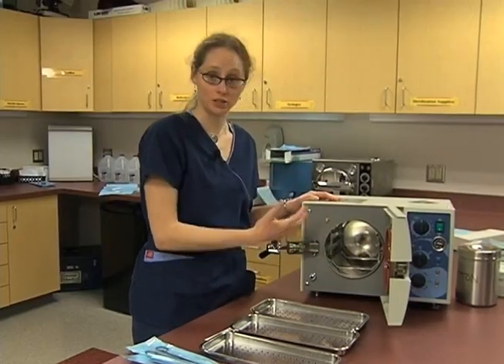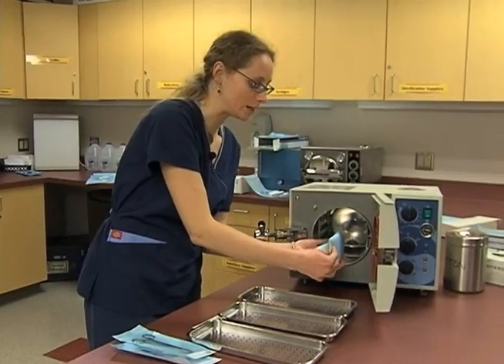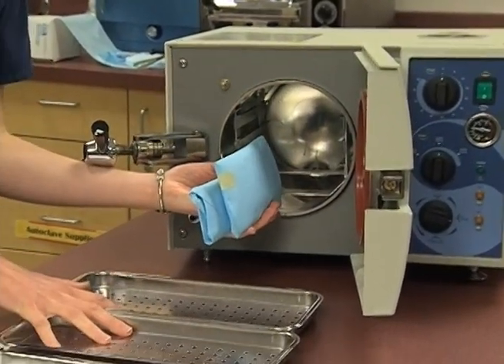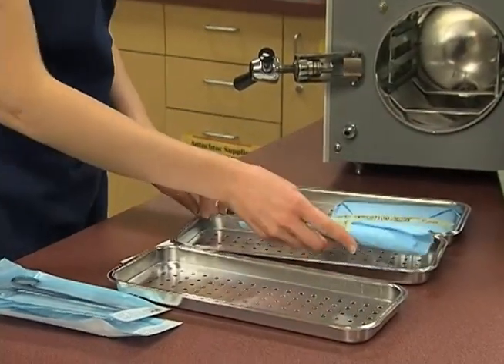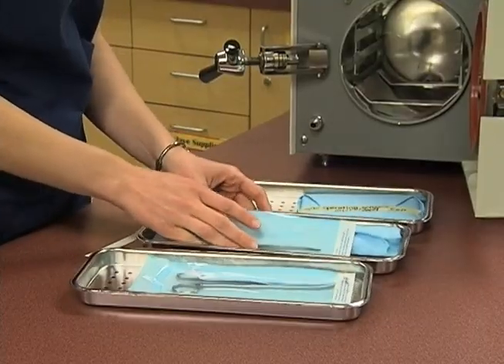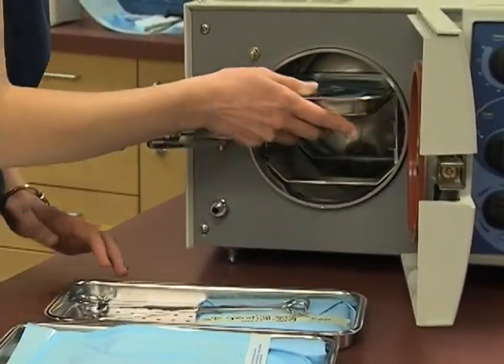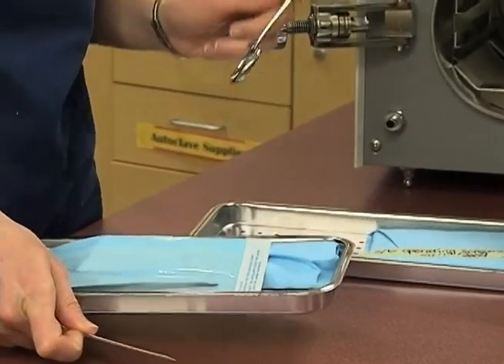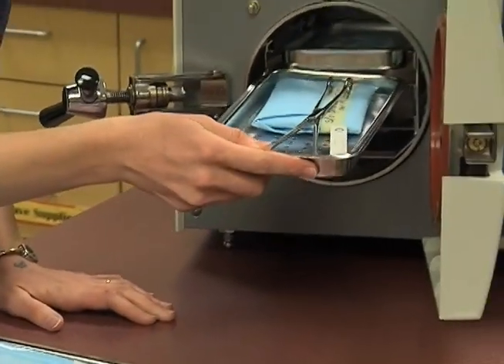Some autoclaves will merely have a chamber that you must fill, and in that regard you would want to stack your items so that the steam could flow up through and around all of your packages. Other autoclaves offer trays to ensure even airflow between all of your packages. We want to organize our items in the trays to allow enough air to move around — but on a small autoclave, we don't want to push it too much. We're also going to include our indicator for any items that are not wrapped.